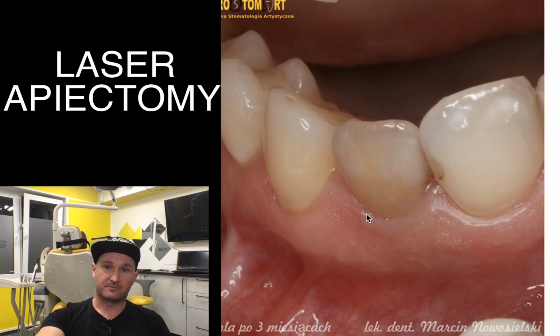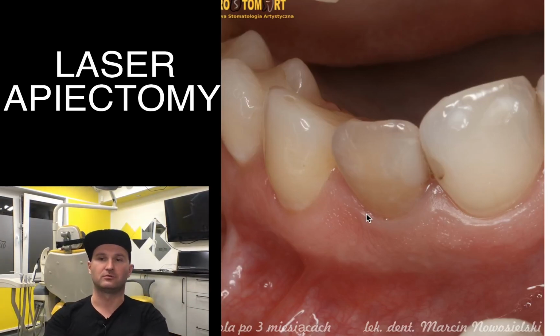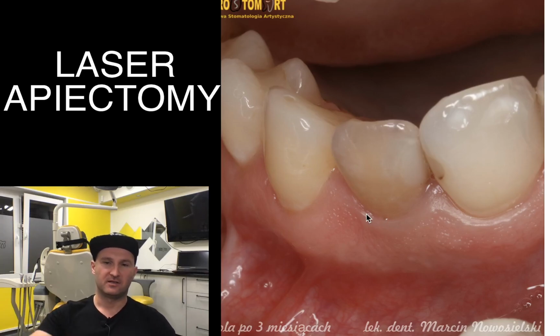So patient was told that she can report to her dentist to proceed with further treatment, with doing the crown on this teeth to solve the aesthetical problem, but also to, let's say, make it more resistant for mechanical failures.